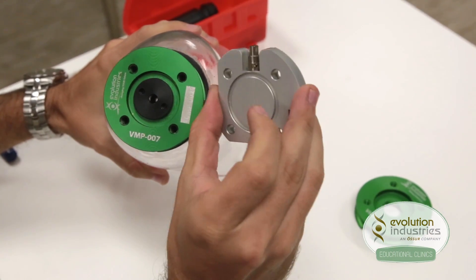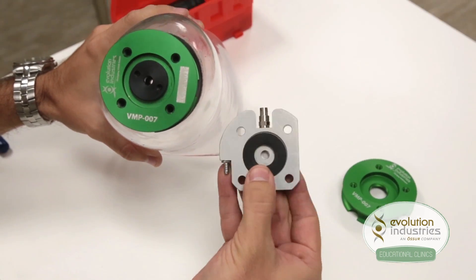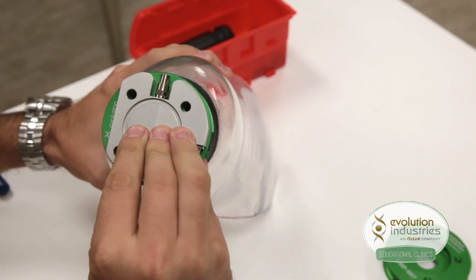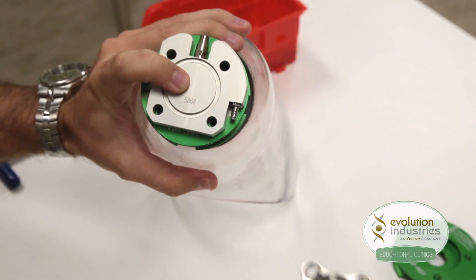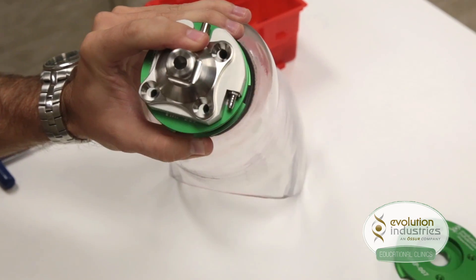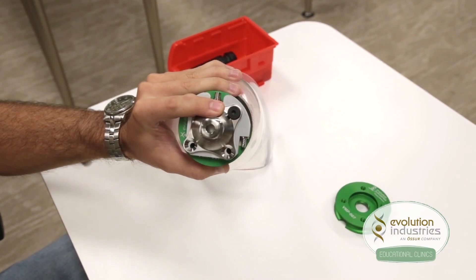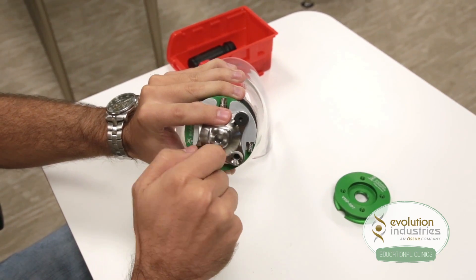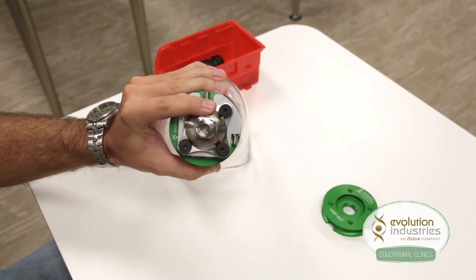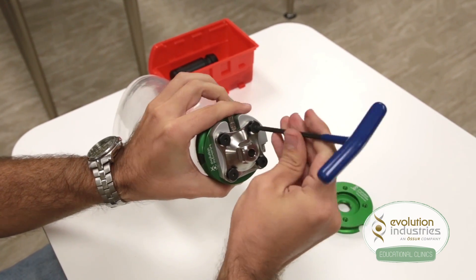Once the valve housing is in place, take your Unity Plate and the large seal provided and fit it into the recess. Slide the Unity Plate onto the valve plate and align it with the four-hole pattern. Take a male or female four-hole adapter, line it up, and hold all the parts together with four screws. Make sure not to under-tighten.